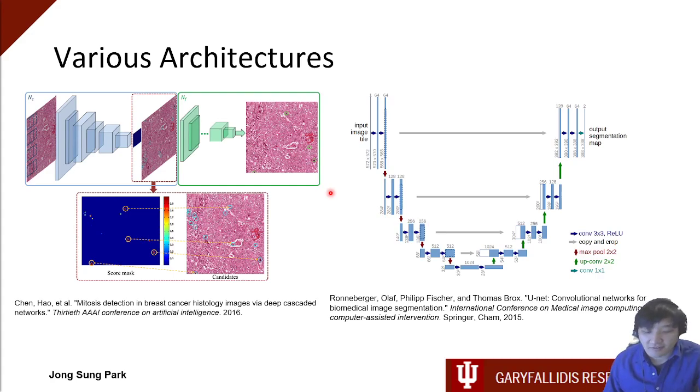This is helpful because in some medical images, it could be the case that there's a lot of unnecessary information around, and we're maybe trying to segment this little blob here. Then we won't need the whole thing. We will just need this part, like here.